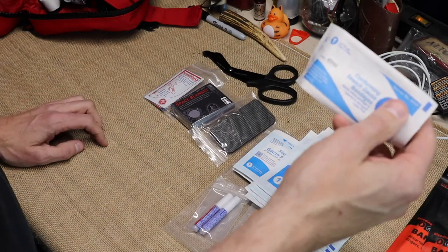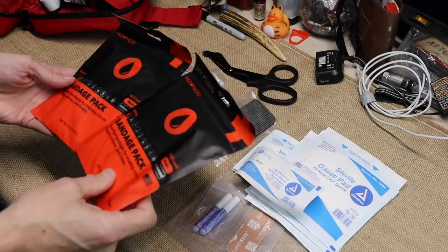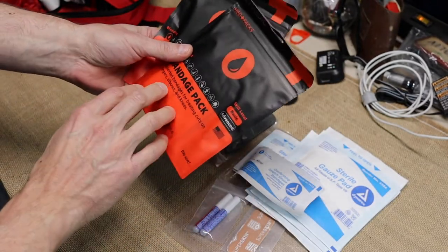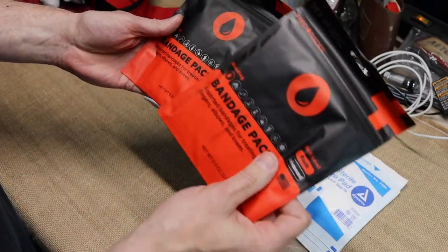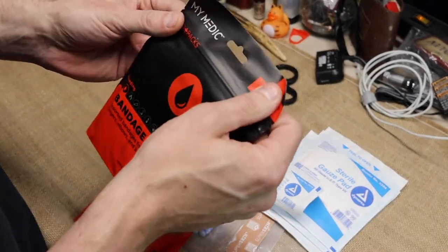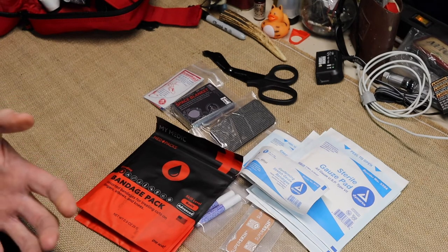You also have stretch gauze bandage to wrap around wounds. You get two bandage packs that come with it, loaded with assorted bandages to treat cuts on fingers, elbows, and knees. Like the hiker kit I showed you, you open it, use what you need, and zip-lock it back.